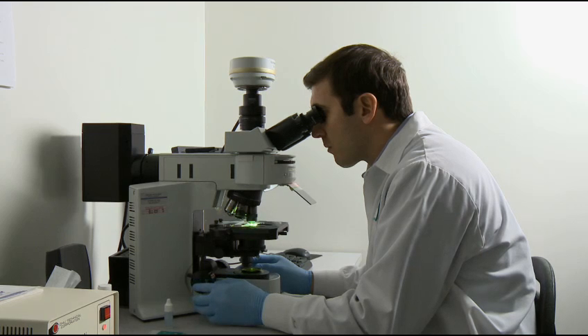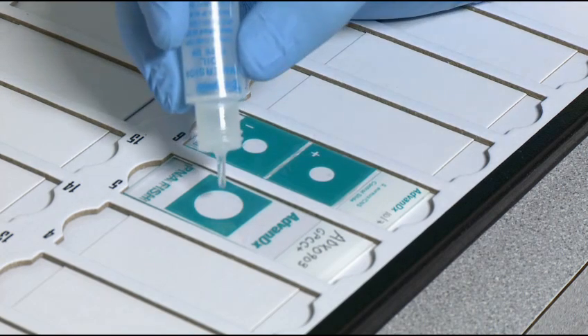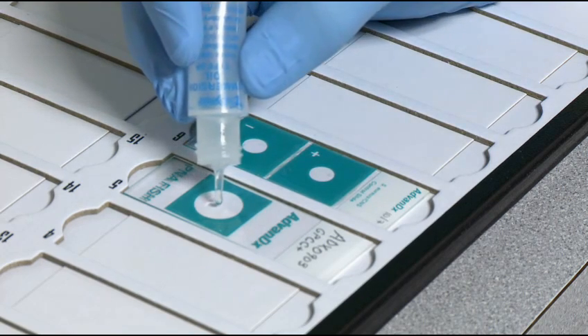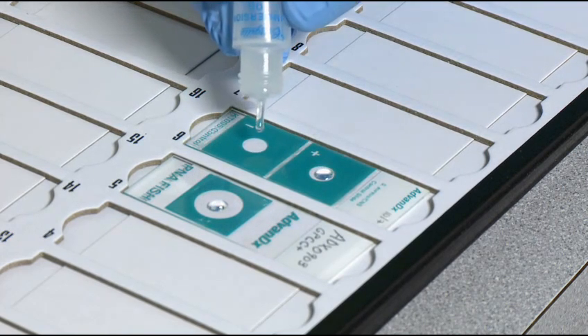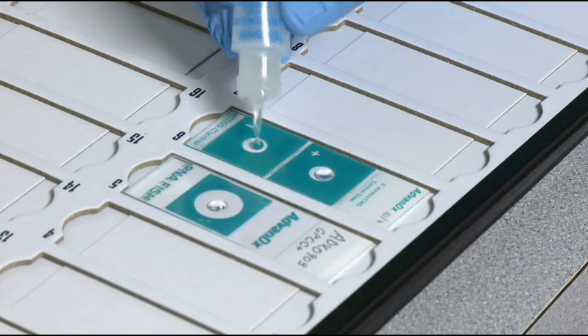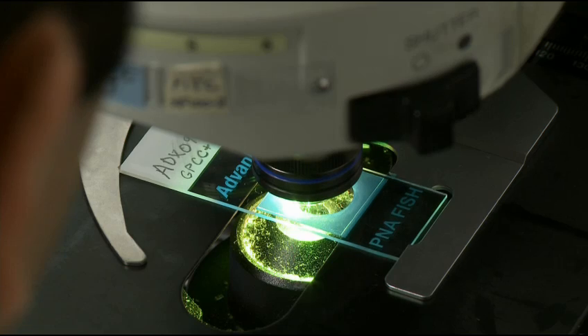The slides are now ready for examination. Add a drop of immersion oil to each cover slip. Start by examining the positive and negative controls, followed by the sample slides.